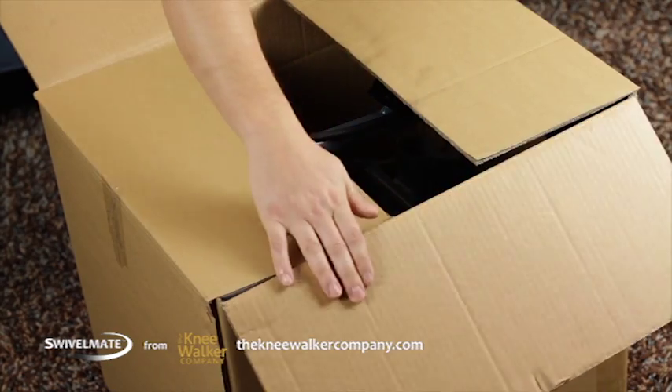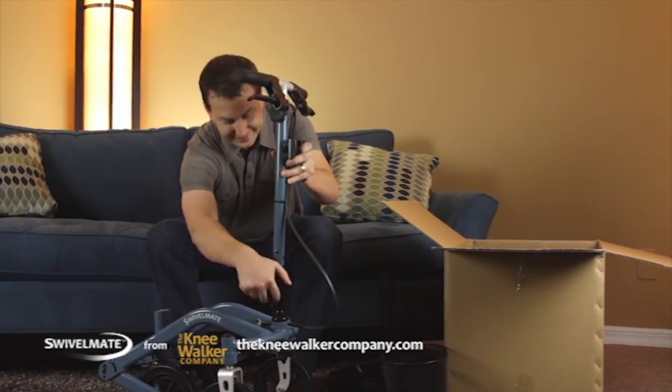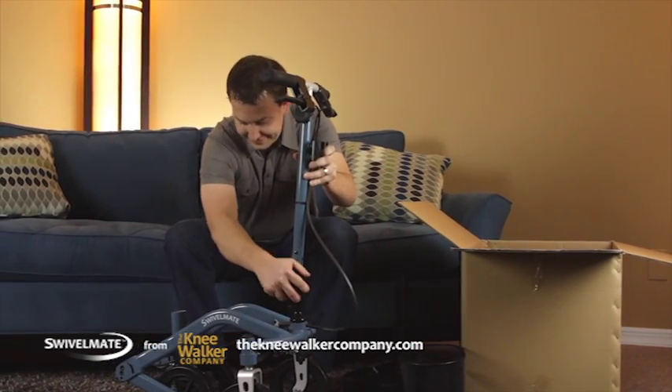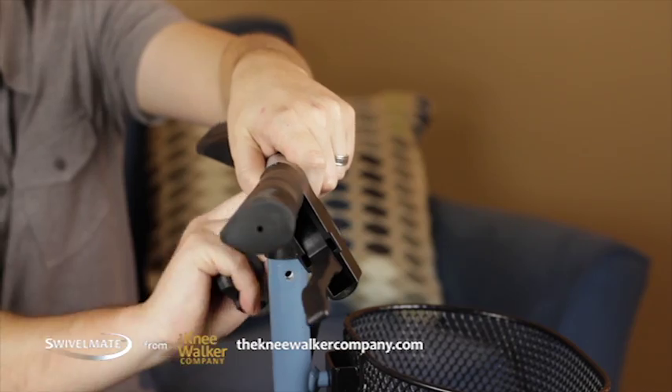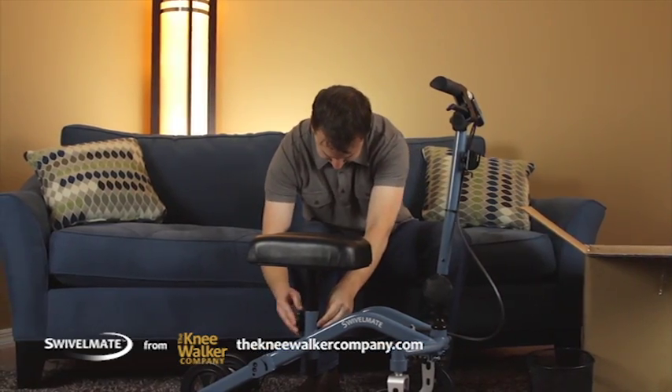Just look in the box. Unlike other knee walker brands, Swivelmate comes fully assembled. No tools necessary. You can even customize your Swivelmate by simply adjusting knobs, handlebars, and knee pads for optimal comfort.